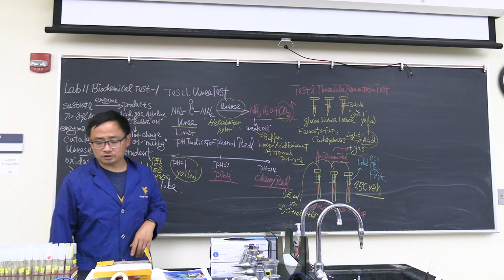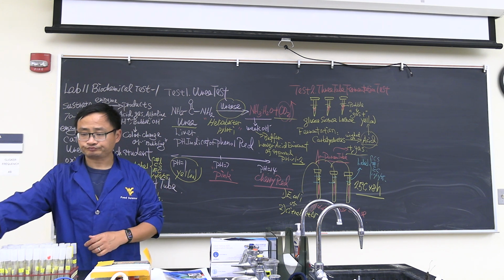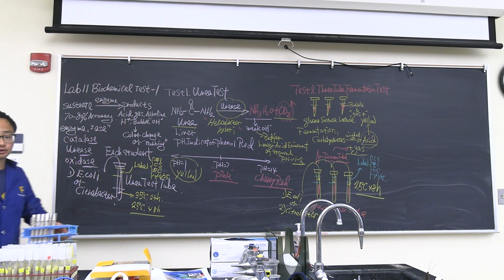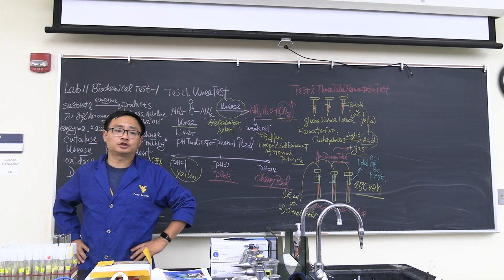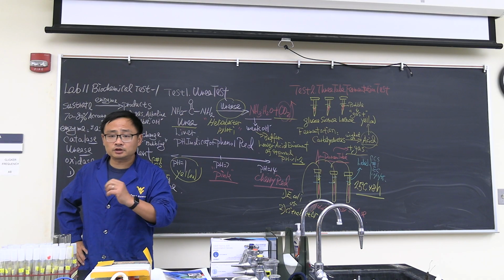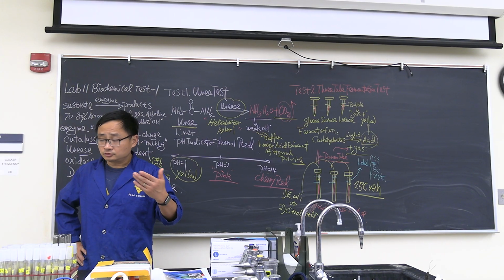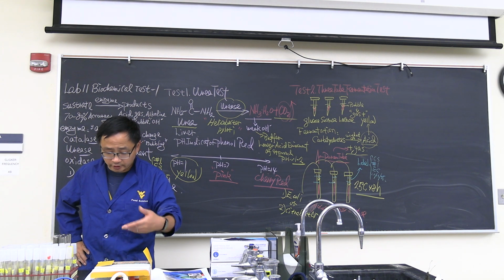So these are the things we're going to do for the biochemistry tests. What else are we going to do? We're going to do the first clinical lab, throat culture. Usually this test we do later, but why do it today? We will have lecture exam 2 next week, Tuesday. Today and Thursday, when you do this, you get some hands-on experience with Staphylococcus, Streptococcus, or possibly Corynebacteria.